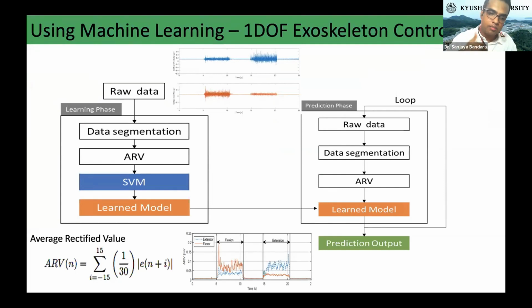as healthy subjects, we have the whole muscle activity, but the patients have very little muscle activity. It may even be zero. Sometimes we can't even see any muscle activity. So in this case, since this is a single degree of freedom robot, the control is pretty straightforward for healthy subjects, though there are some problems like muscle fatigue or muscle crosstalk between these two muscles.